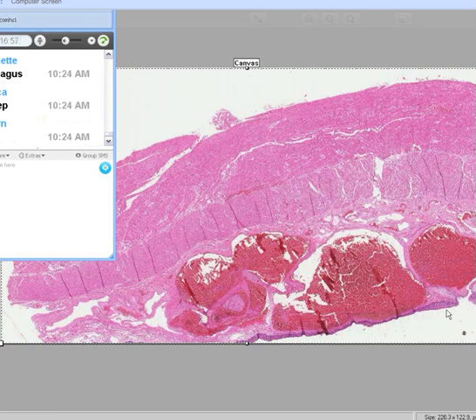Which of the 4 layers has the problem? The adventitia. Of course, it's the submucosa, because you have all of these huge, horribly dilated vascular spaces in the submucosa.